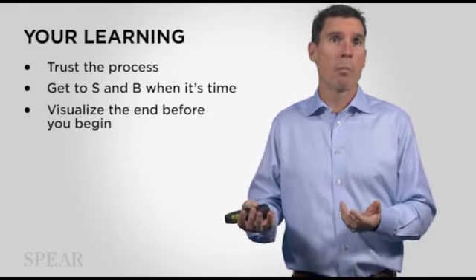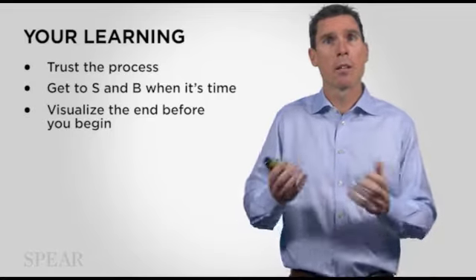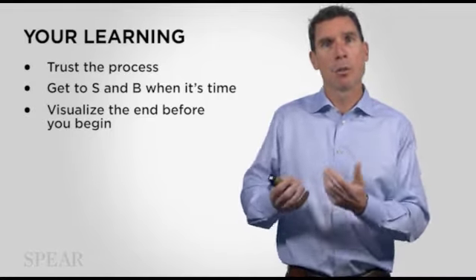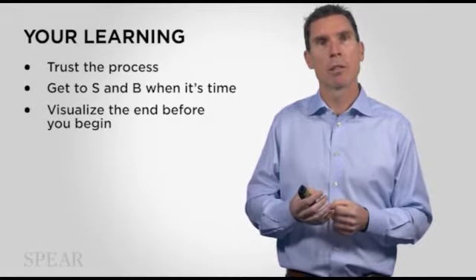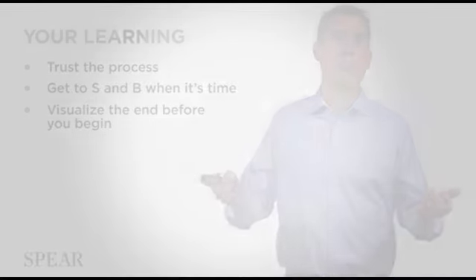Did I want to put a provisional on there for the tissue? Did I want to take a separate impression for the implant? So what was the timing of the healing? By doing some of this yourself and working with your specialist really helps. And by the way, recession for the upper cuspid. We never got back to that for the biology. Well, I may have completely missed it if I wouldn't have trusted this process. And for her, maybe you didn't even notice, we just covered it right up to the gum line because that seemed to be the appropriate thing for her. But we knew what we could have done for that.